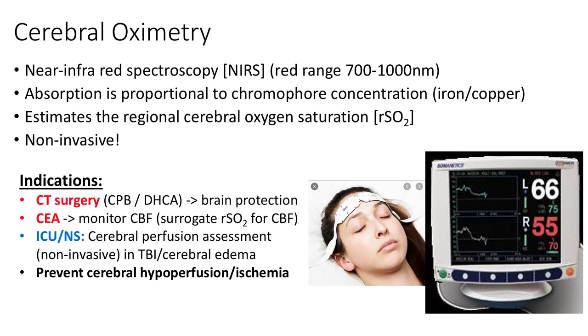But the same problem then BIS faces. This is not sensitive enough for regional changes in cerebral blood flow and cerebral perfusion. It separates left and right, but not between frontal, parietal, temporal, or occipital brain tissue. So there really is no good gold standard for clinical brain oxygenation assessment. We all still use surrogates and suboptimal monitoring options, but it's up to you to interpret the information appropriately.